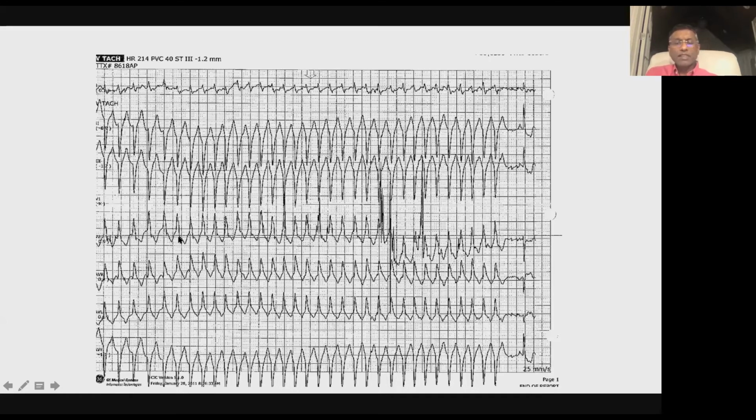The other fact you mentioned is that this looks like a wide complex tachycardia, and I completely agree with that. It looks wide. And it doesn't look that wide, frankly, when you pick up the tracing, especially on this side. If you just had this lead, you'd say, I don't know, it looks a little wide, I'm not sure. But now that you have a narrow complex here, this is definitely wide, correct? You can see the definite wide.